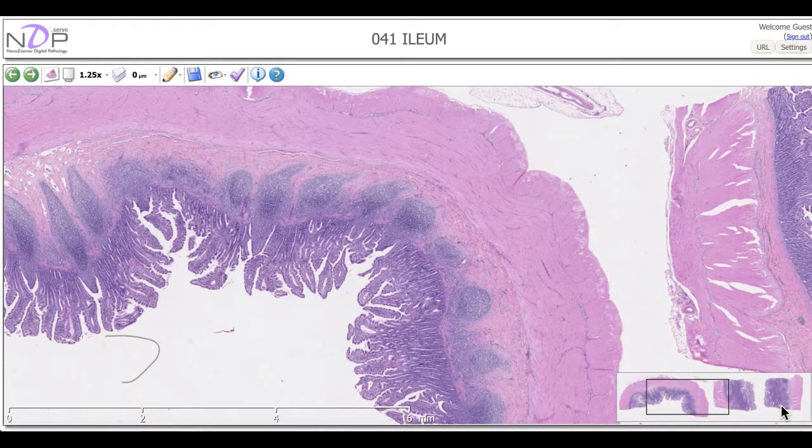In this slide of the ileum, we can see two examples of two things I talk about in the lecture. We talk about the diffuse unencapsulated lymphatic tissue, and I talk about the dense and unencapsulated lymphatic tissue. In this slide we have an example of these two things.